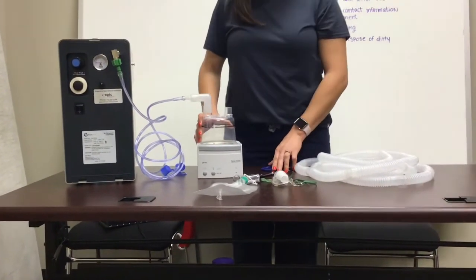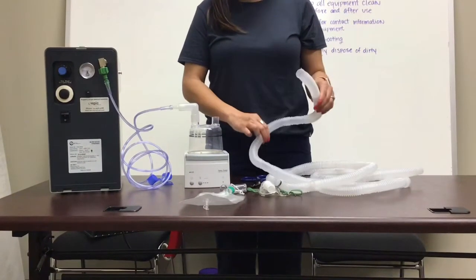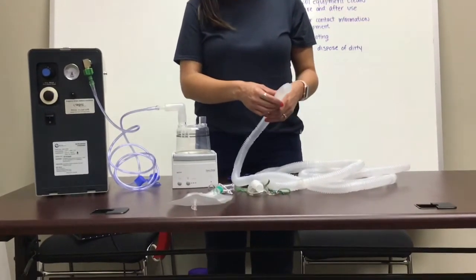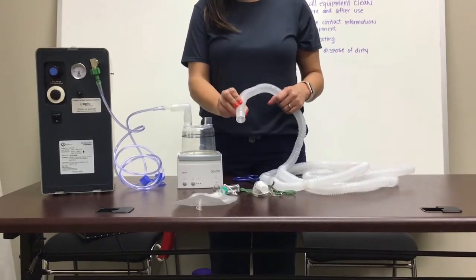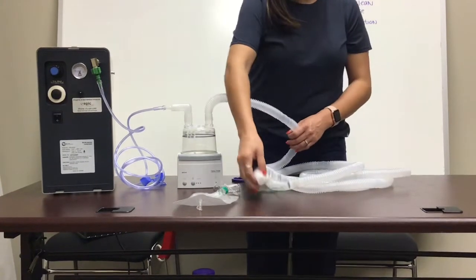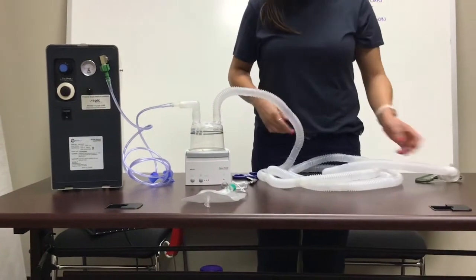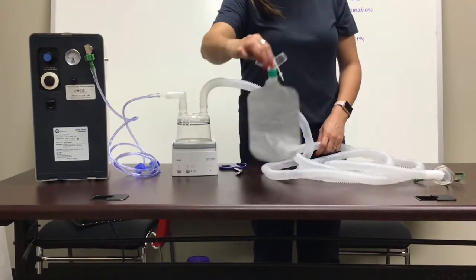Next, you will be having to connect your corrugated tubing to your water chamber. We will be providing you with 100 feet of tubing, so this will need to be cut to the length that is needed from the machine to the patient, allowing some slack for movement. Once you have cut your recommended length, you will then attach one side of your corrugated tubing to the top of your water chamber port. On the other end, you would connect your trach mask. Now you would go through your tubing midway and cut to be able to place your water trap in between.